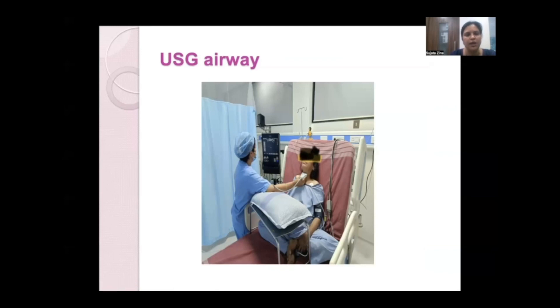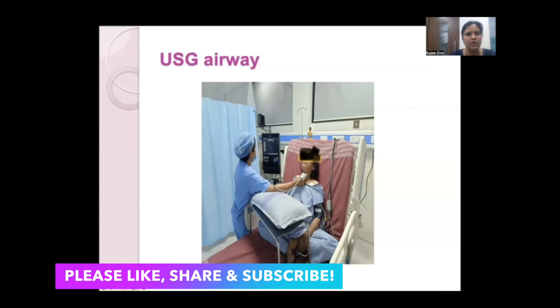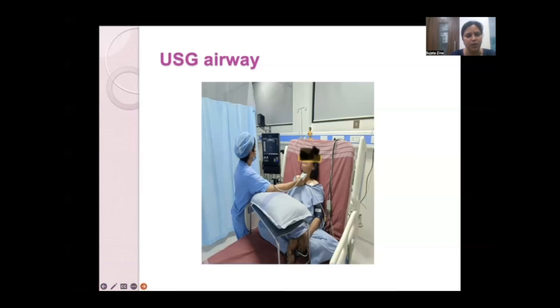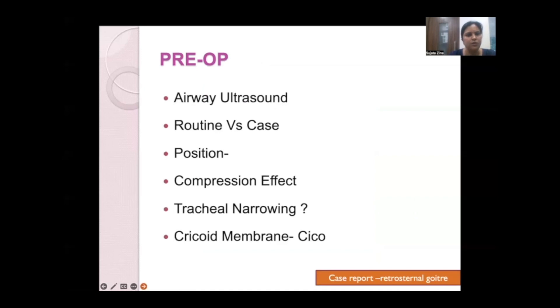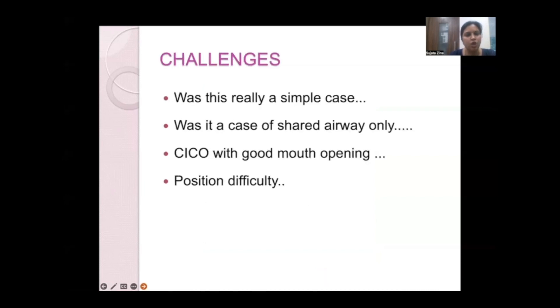Airway ultrasound screening was performed with unique challenges — routine scanning is done supine with head extended, but this patient could not lie down. Screening was performed in the 90-degree propped-up position with hand support to locate the cricothyroid membrane. This was done very gently since probe pressure itself could add compression the patient might not tolerate. The goal was to identify the cricothyroid membrane for plan B or plan C access in case of emergency.